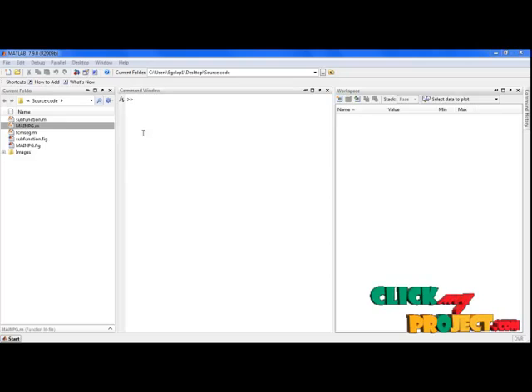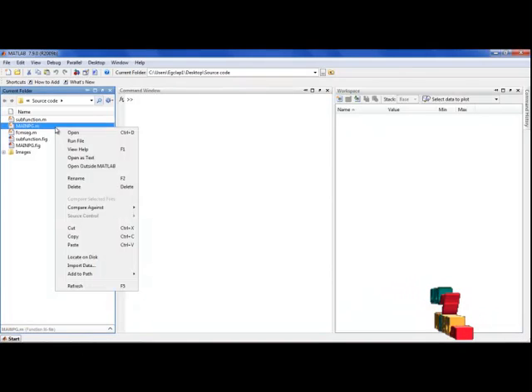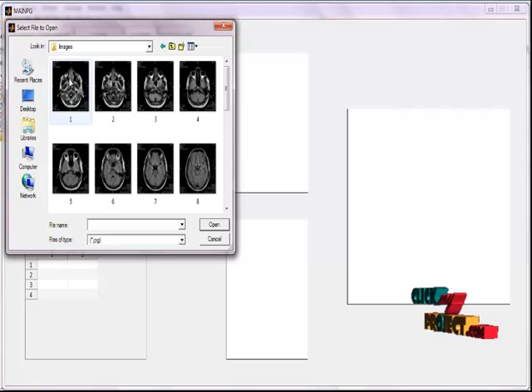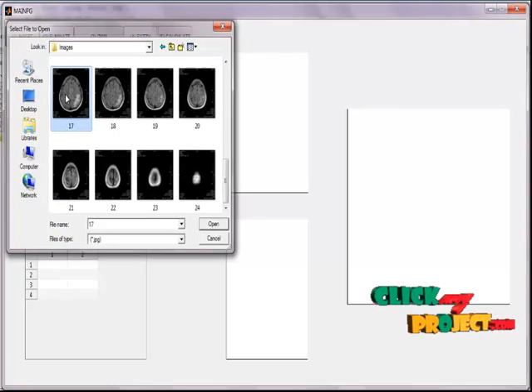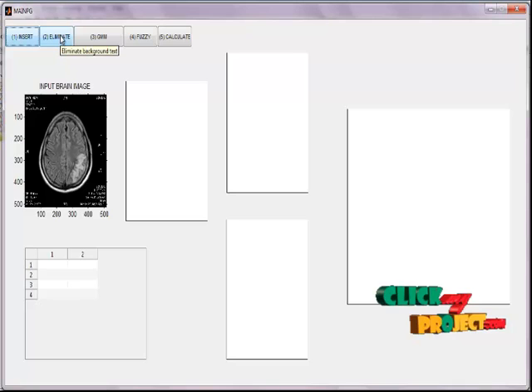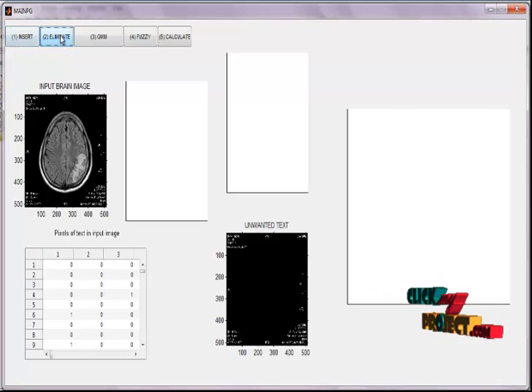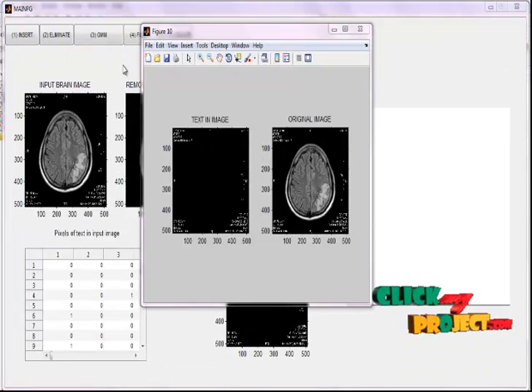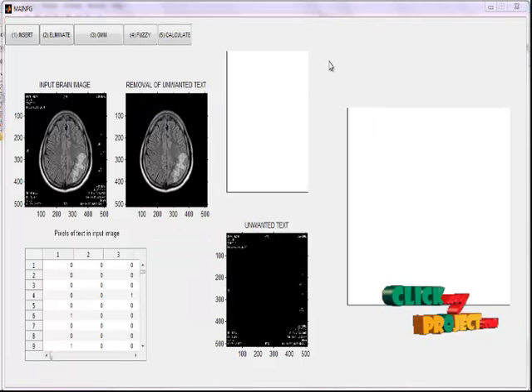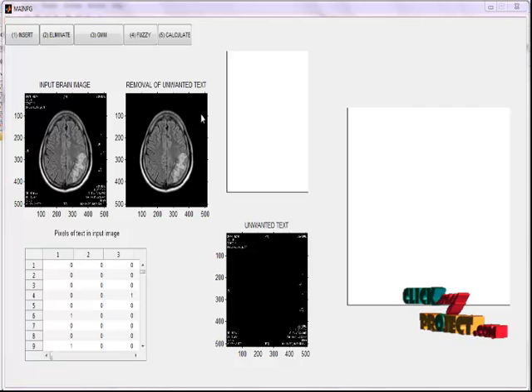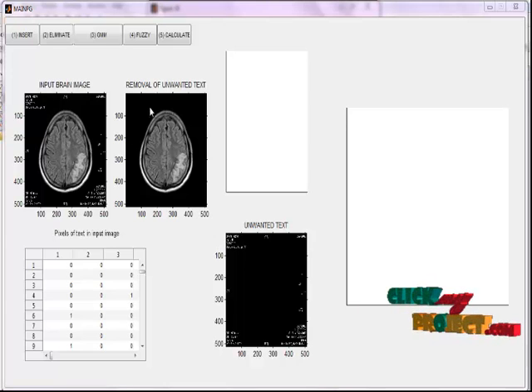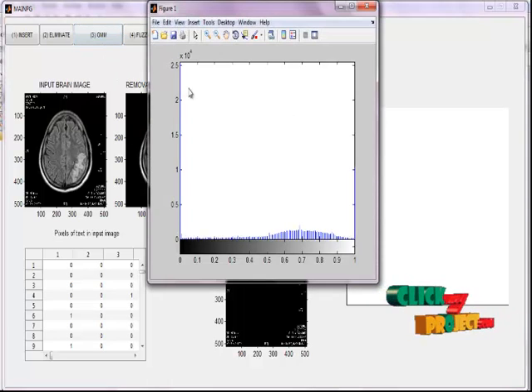Let's see the running process of our project. Here, we just run the main pg.m file. This is the GUI window of our project. In the first step, we insert the image. This image contains both the brain image and text information. We eliminate the text information by clicking the eliminate button. The image displayed in the axis shows the removal of unwanted text. After that step, we give the brain image to GMM by clicking the GMM button, which extracts the Gaussian Mixer Model.